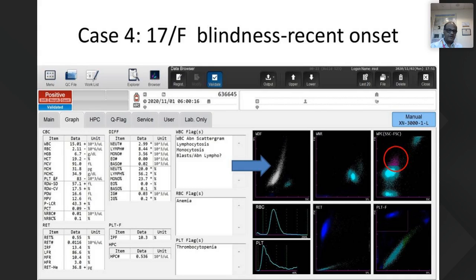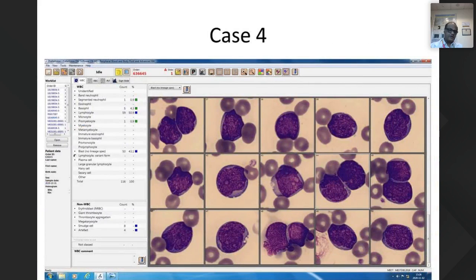CBC was sent over here, and you can see that on hematology machines, we know that scattergrams are abnormal. To guess immediately what the report is, you can just put it on the CellaVision, which has a pre-classified group of blast cells. You can see the blast cells over here, flagged off by your machines, along with the percentage saying that it is more than 40%.